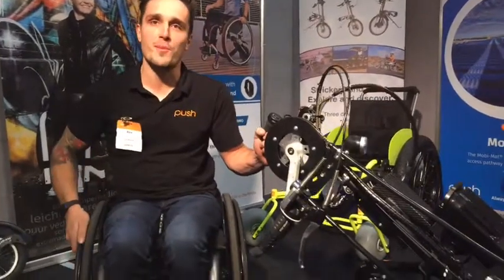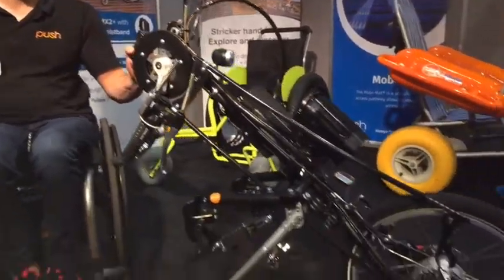Hello everybody, coming at you from the Push Mobility booth at the ATS Expo here in Brisbane. We've been having a really good day so far and I'm going to take you guys through our really great product, which is the Stricker Hybrid Hand Bike Attachment.